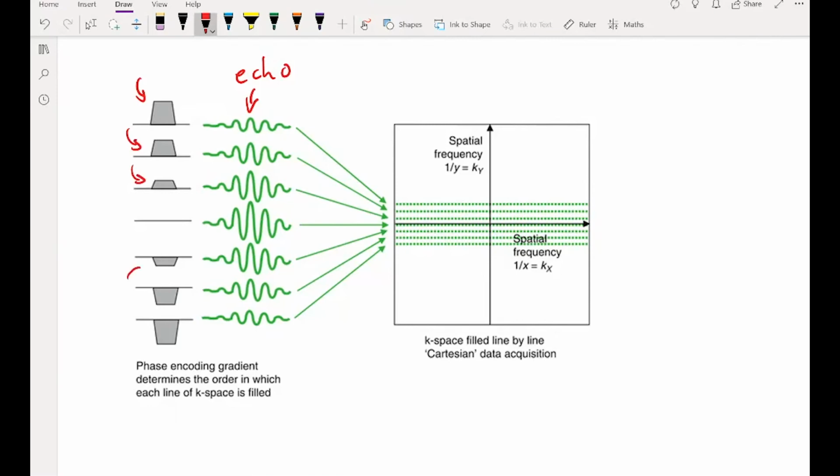Or we can apply the same phase encoding gradient magnitude and wait a different amount of time, which is another option, although that typically tends to lengthen MRI scans, so it's not typically done. It is possible though. Another advantage of doing different phase conditions is that we can encode that phase information whenever we want. So we don't need to be doing that just when we're recording signal.